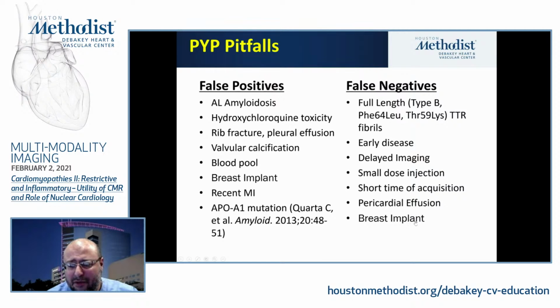And we are shying away now from the ratio because of all the technical issues that may potentially go wrong with it and may give you a number which may not represent what is in the case. So focusing more on the fused images or SPECT images will help you delineate those cases that are truly positive in these patients.